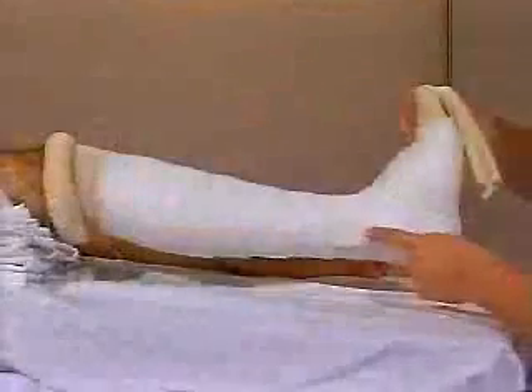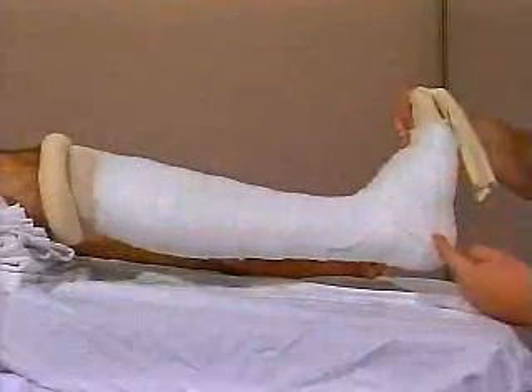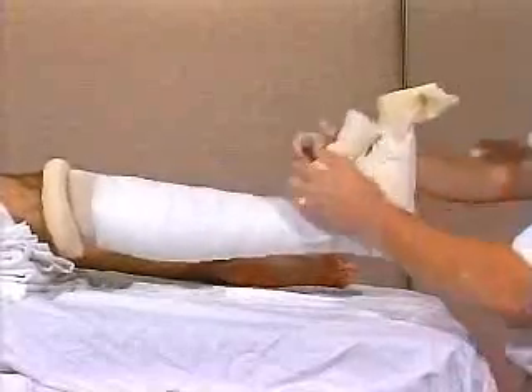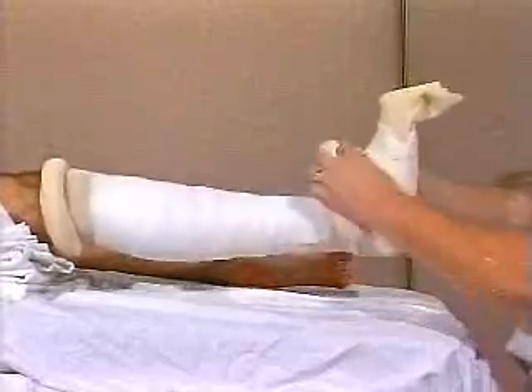Extend the padding more proximally for the upper half of the cast. Place the ankle at 90 degrees and start the first layer of plaster at the base of the toes. Wrap figure of eights around the ankle and extend proximally.